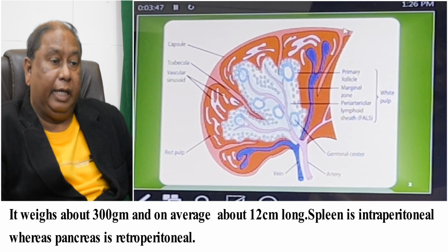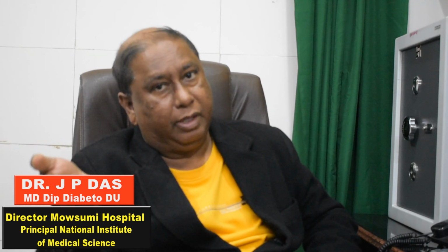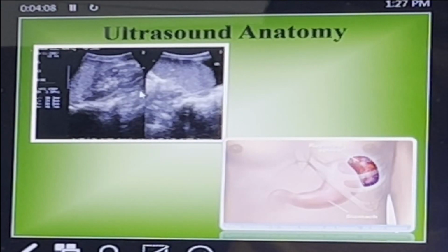Spleen is intraperitoneal, whereas pancreas is retroperitoneal. Pancreas remains behind the peritoneum, and spleen remains inside the peritoneum. Now come to the ultrasound anatomy.